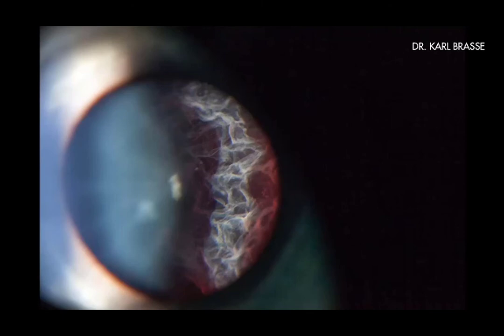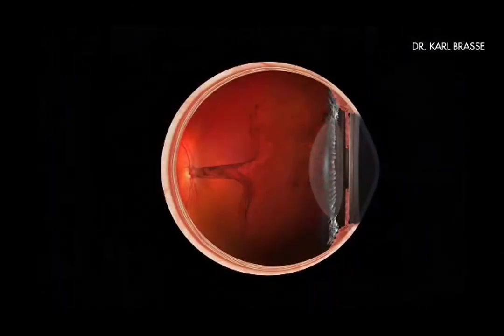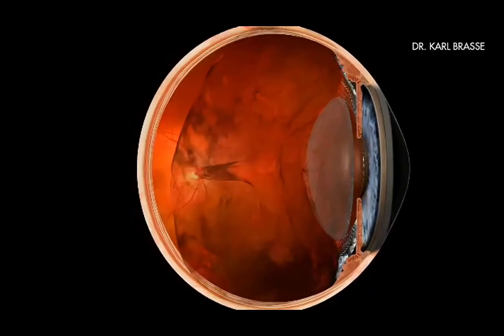The amyloid material is very much concentrated in the posterior vitreous membrane. This might have been the reason for the posterior vitreous detachment, which you normally do not see in a 22-year-old. Here you see that the posterior vitreous membrane has lost its transparency, which is the reason for the massive visual impairment. To classify this case precisely, we have a mixture of Group 2 because it is histoanatomically the posterior vitreous membrane and amyloid which belongs to Group 5. To be able to better understand this unique case, I have built a 3D model. The posterior vitreous membrane is detached but still sticks to the optic nerve head.